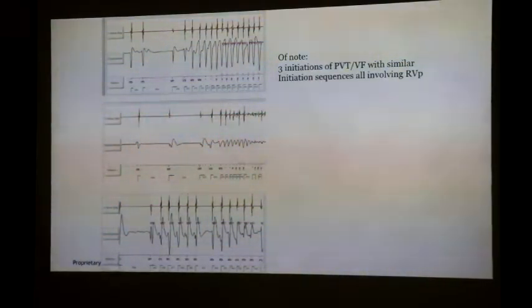You could AAI pace potentially, if it's sinus driven, right? You could AAI pace, that's safe. Does changing the amplitude or the duration have any effect? Dropping the rate has been shown not to help pacing-induced tachycardias in single chamber devices. You might be able to help in dual chamber by putting the rate up. So it's just pacing at a vulnerable period.